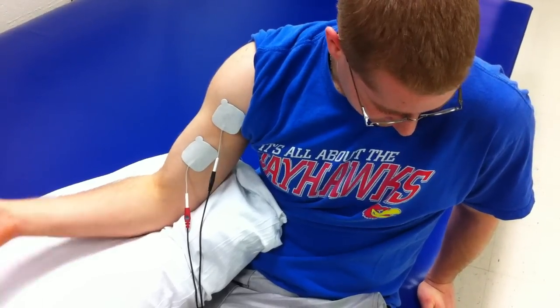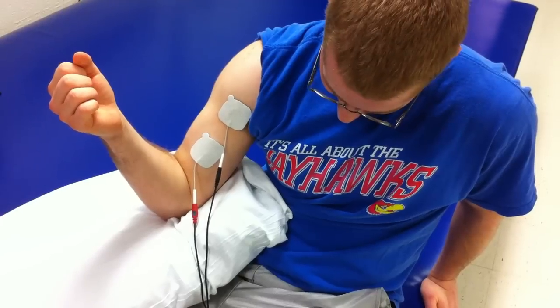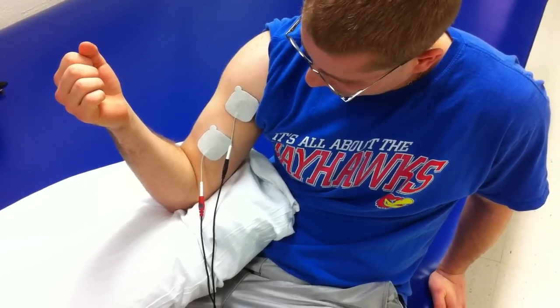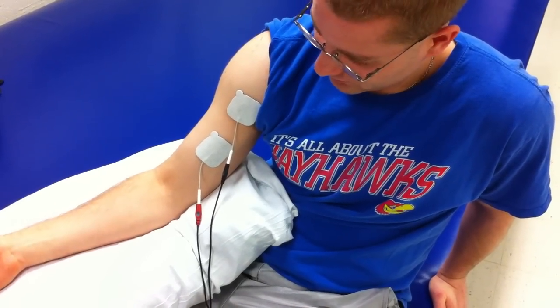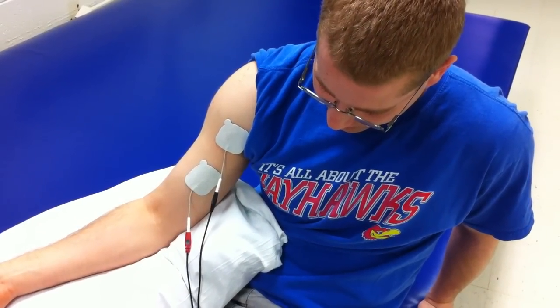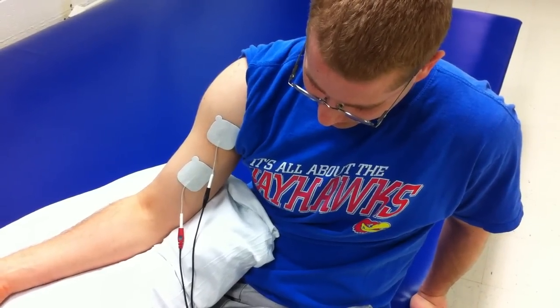Our treatment goes on again — there's the muscle contraction, 10 seconds on. Eventually with this treatment, if you do this multiple times, there may be a bit of accommodation, at which point you might have to turn up the electrical intensity. And that's Russian E-STEM.